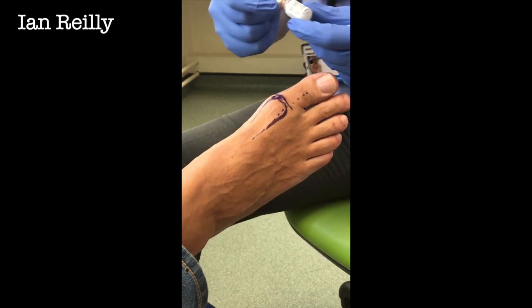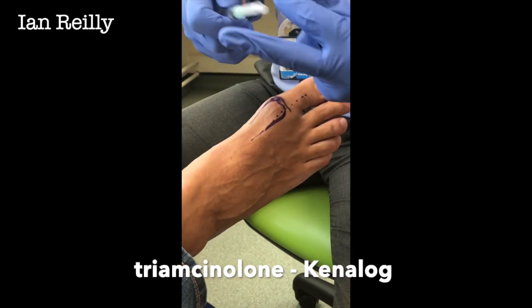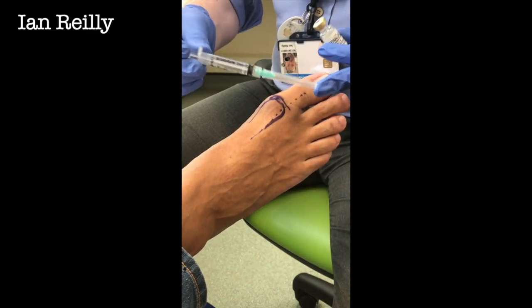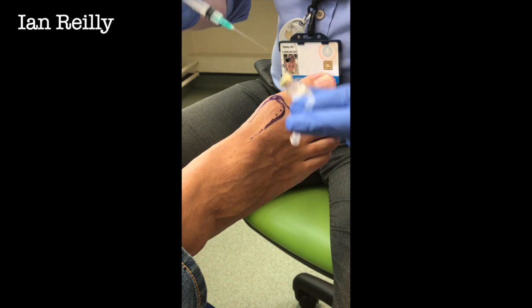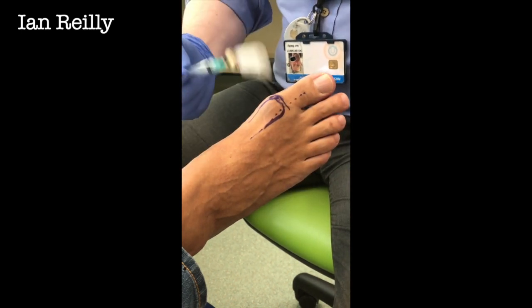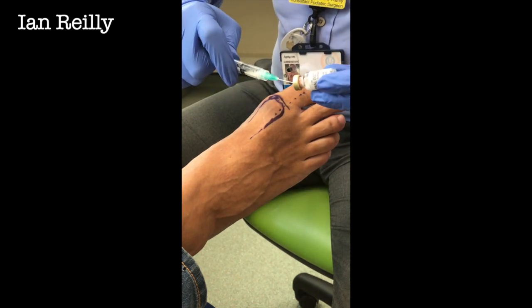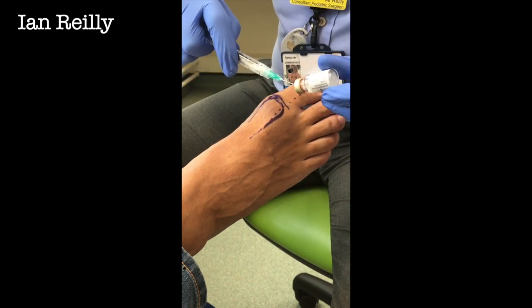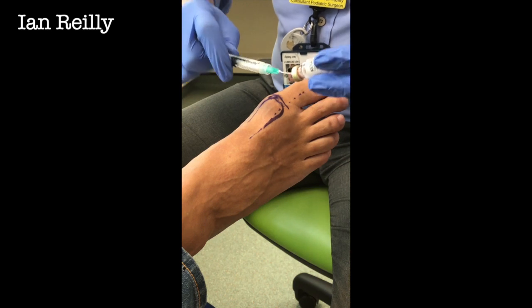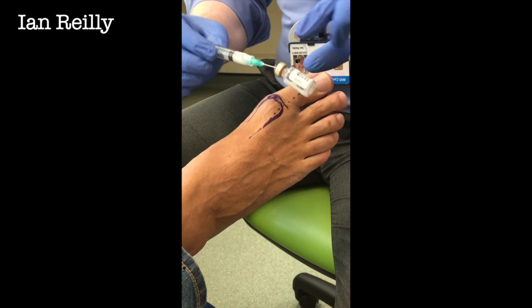So it being a joint injection, I like to use Kenalog, which is my favourite injection for the joint. Small syringe, green needle, 21 gauge to draw up with. We're going to put this in without any local anaesthetic. We're not going to mix this particular one. You can mix, but you can't mix in the syringe. I quite like to use Kenalog neat.